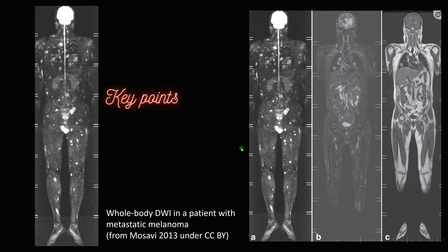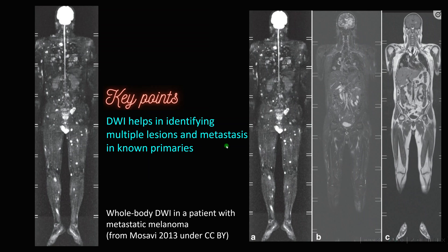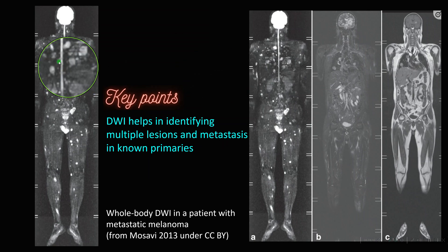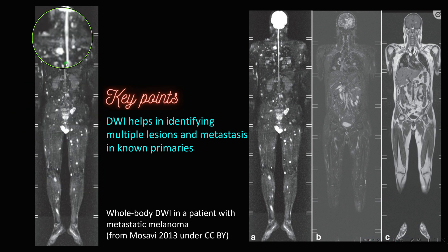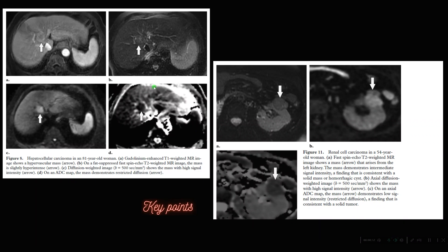DWI also helps in whole body MRI. When you perform whole body MRI, DWI helps in identifying multiple lesions and even metastasis in known cases of primaries. This was a case of metastatic melanoma — you can see there are multiple lesions scattered throughout the body on whole body MRI.